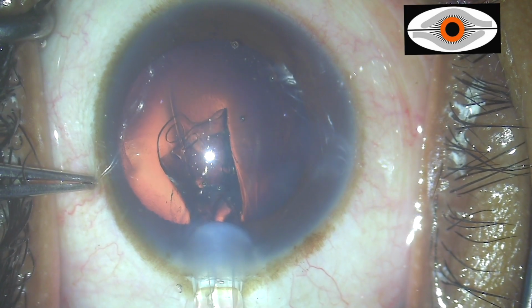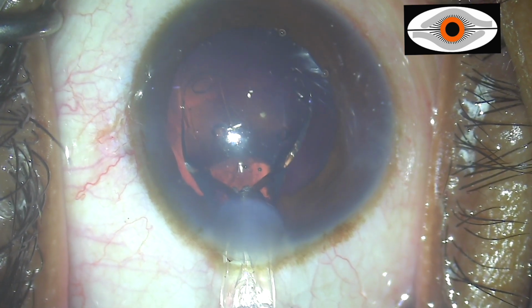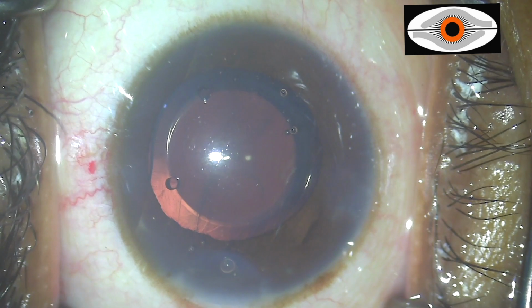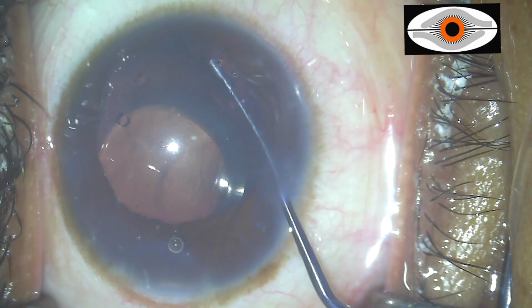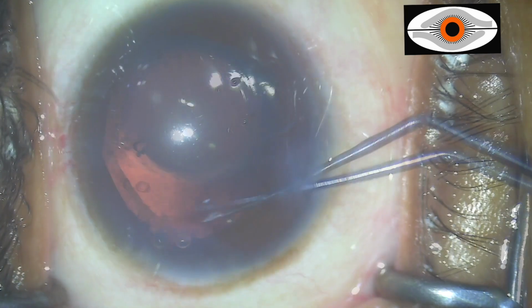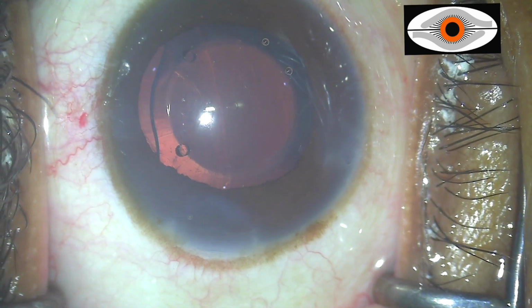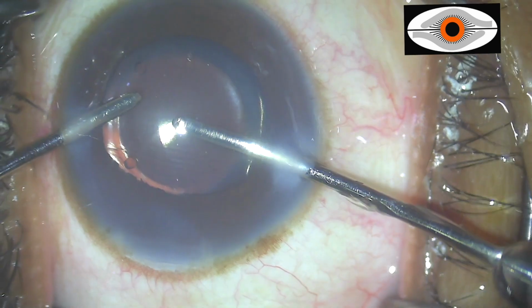The new IPCL is implanted very slowly under direct visualization, thus ensuring very slow unfolding of the IPCL. Gradual implantation helps to identify the landmarks in the IPCL for correct orientation. After ensuring the correct orientation, all the four haptics of the IPCL are tucked underneath the iris. Complete removal of viscoelastic is ensured by thorough irrigation and aspiration.